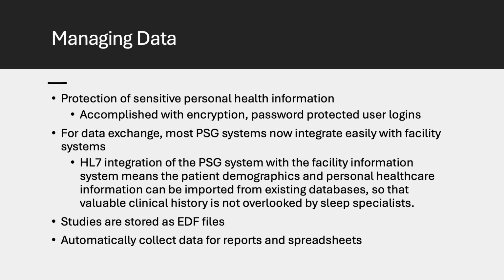Digital PSG has become more reliable with the inclusion of such technology as automatic disaster recovery, which in the case of power outages automatically restarts the system and appends to the existing record, and that's fantastic. Compumedics and Cadwell both do that, and it was great.